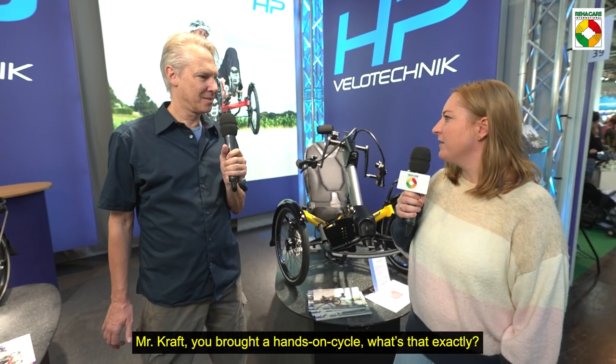We are here at REHACARE 2022 at the booth of HP Velotechnik with Alexander Kraft. Mr. Kraft, you brought a hands-on cycle. What's that exactly?